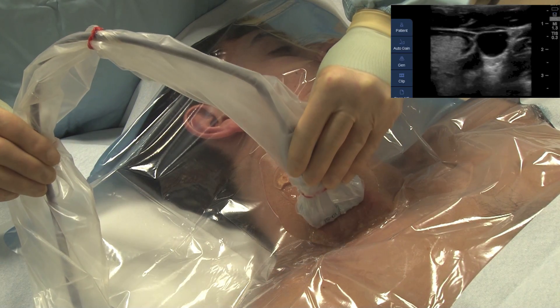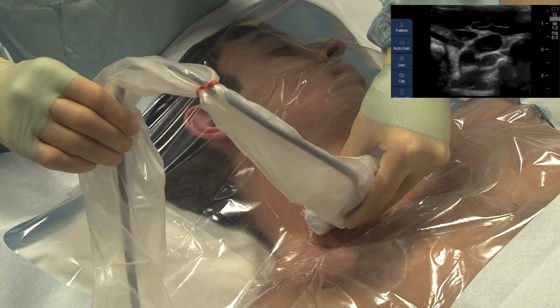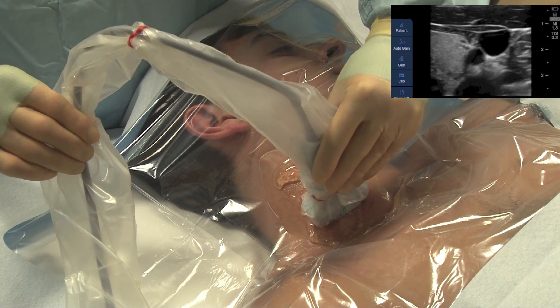Note that you can also change your view by changing the angle of the ultrasound probe on the tissue.